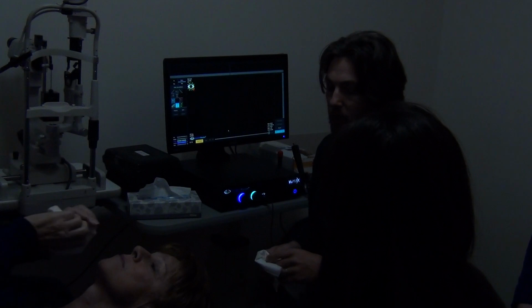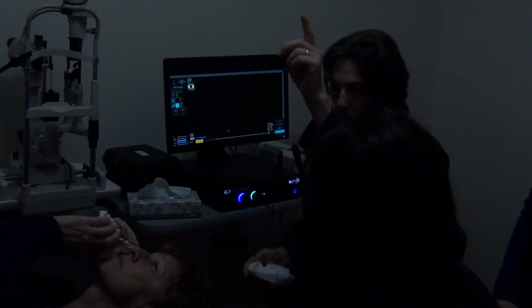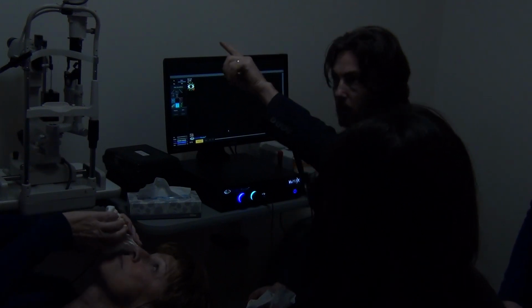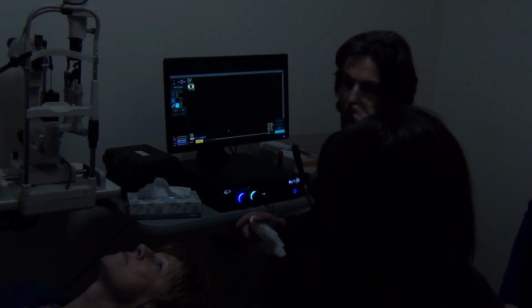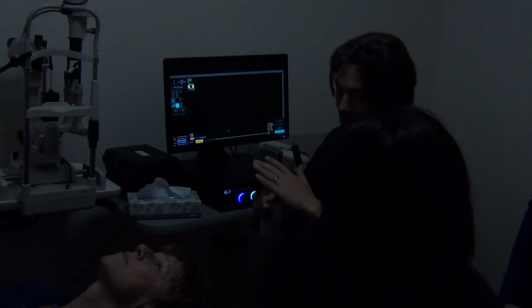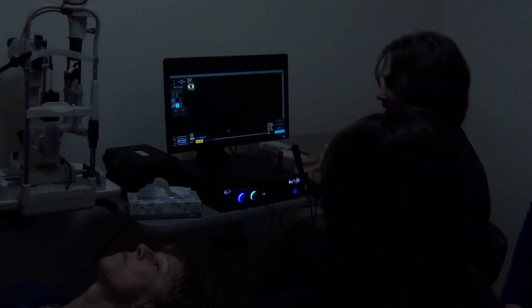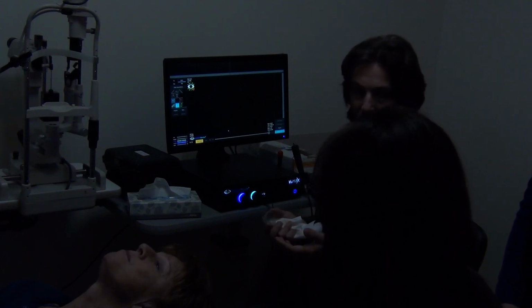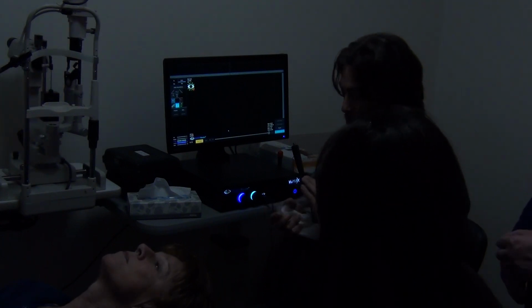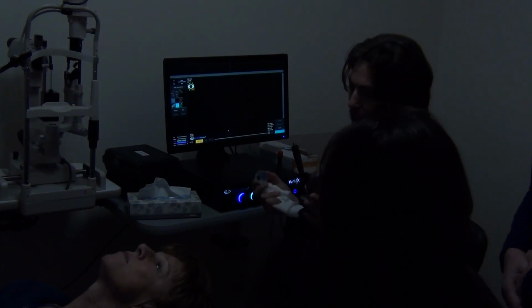With the angle measurements, I would recommend to point with the finger, just go here or there, because sometimes we tell them look left, look right, they go far left, far right, beyond the shell, and it kind of rubs against the cornea, so you want to avoid that. In case, it wouldn't scratch the cornea, but you know, you don't want to take chances.